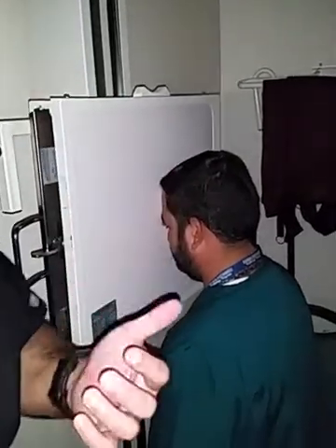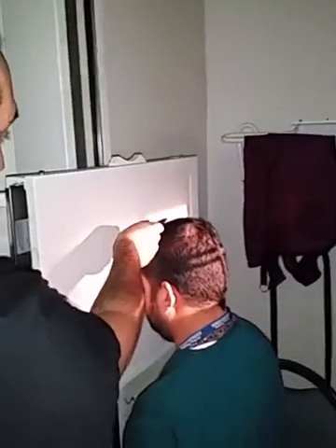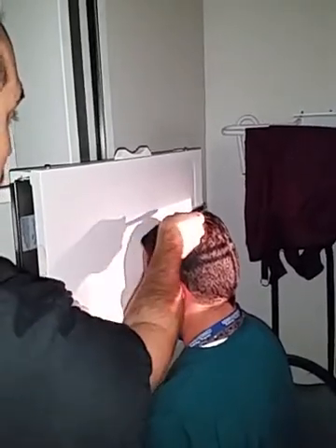So he's one of the nice people. Some people it won't line up, okay? You're going to have to get them to balance like on their nose or something to line up the OML. The other thing you want to do, so I'm going to open this light field up so you can see, I need from the top of his cranium, which means I need to be able to see a little bit of light field above the top of his cranium.